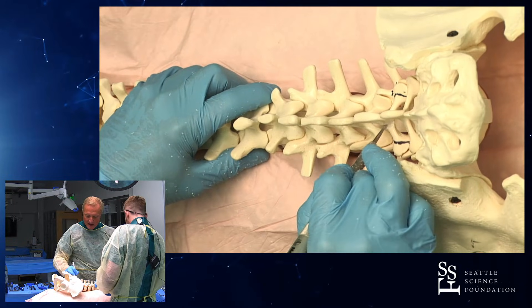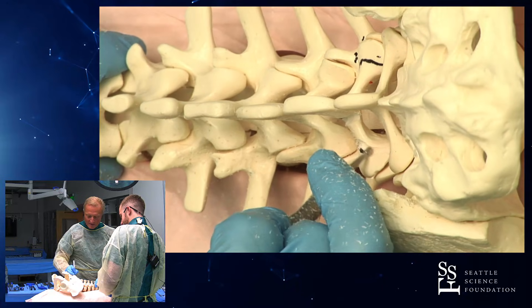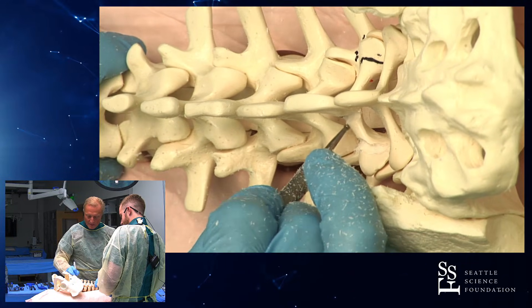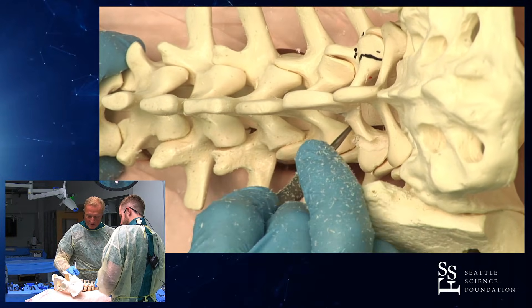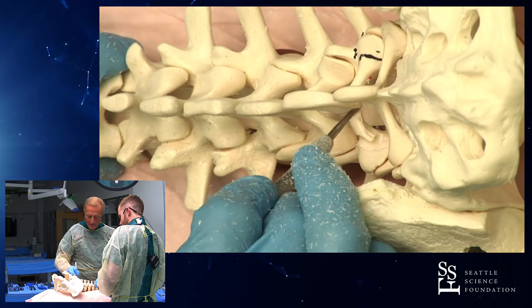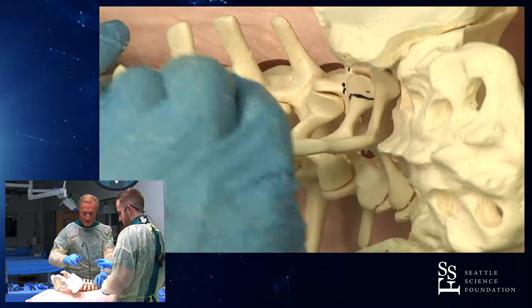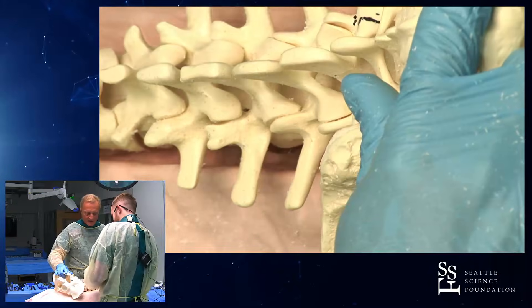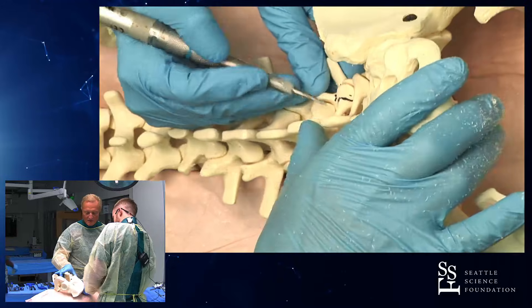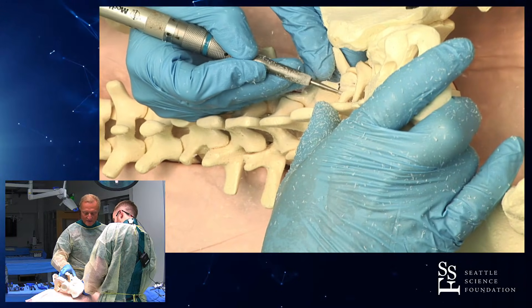We're gonna do it with a high-speed burr under irrigation, which we don't have right now here. Do the same thing and this gives us access to the spinal canal. We're preserving the interspinous ligaments and the facet capsules are totally spared.